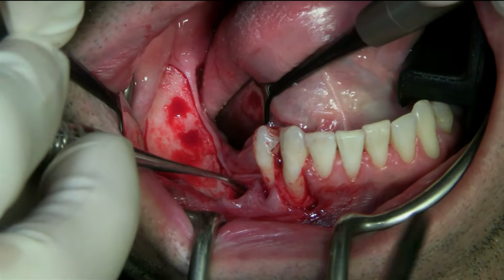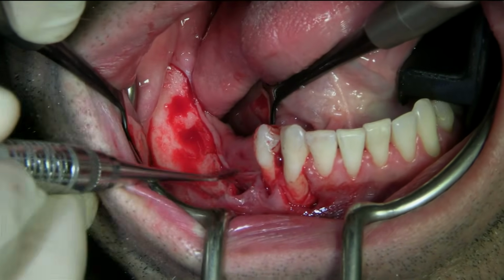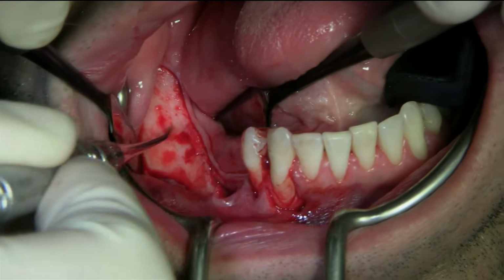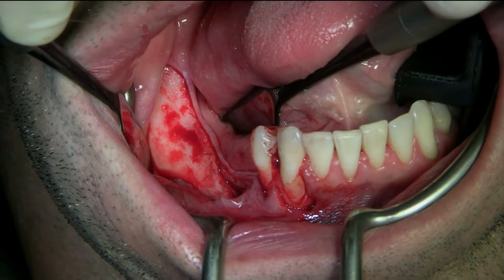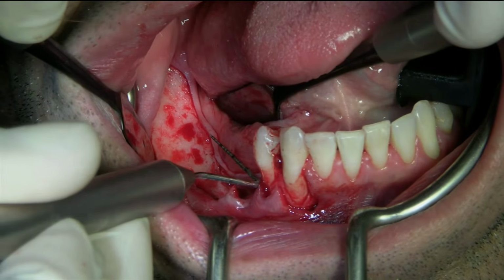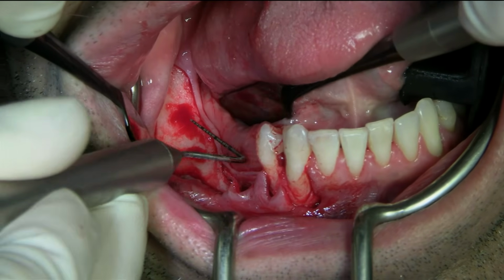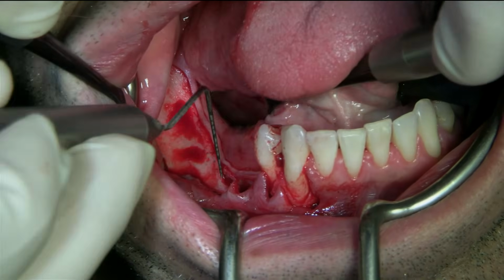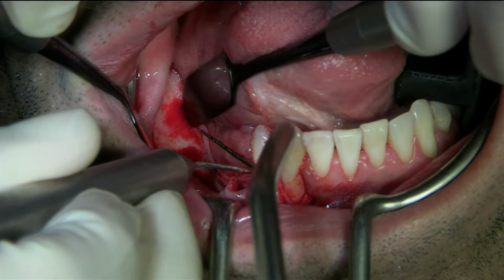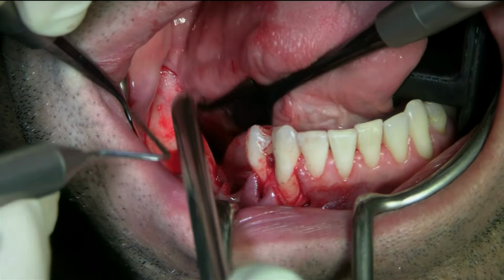So it's a pretty large area, but everything is loose at this moment. And I want to bridge that defect and go somewhere with the membrane from here to there. So let me have a periodontal probe. So that's about 30 millimeters long. And then of course I need to go all the way from the lingual towards the buccal. So 30 by probably 40. So what's the membrane that we have? Can I see the membrane?